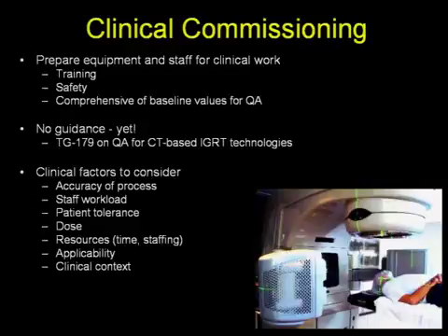It's also at this time that additional safety issues are addressed and comprehensive baseline values are acquired for quality assurance. As for many new technologies, there is no guidance yet for image guidance technologies QA. However, the AAPM TG 179 was created last fall with the focus on quality assurance for CT-based IGRT technologies. A white paper is in the works and should be published within the next year or so.